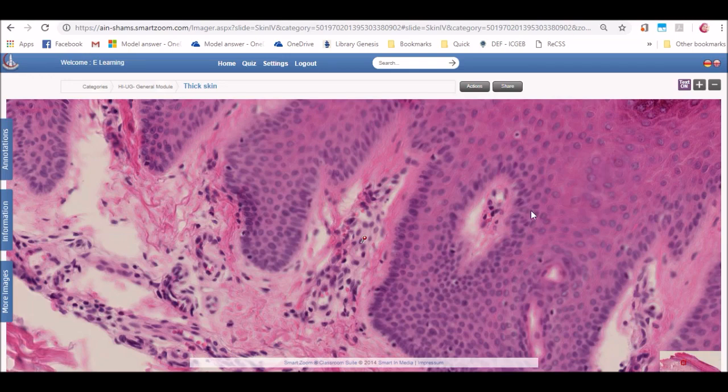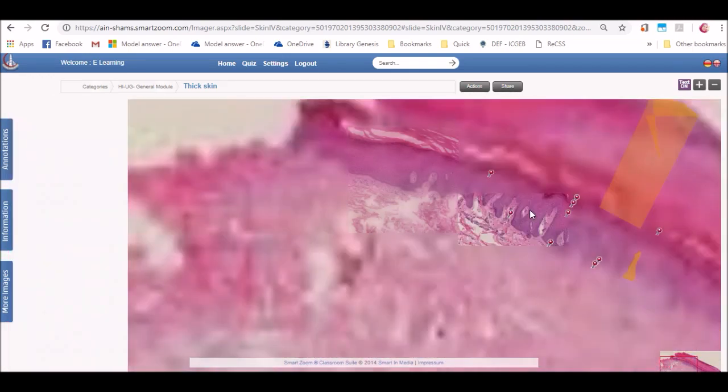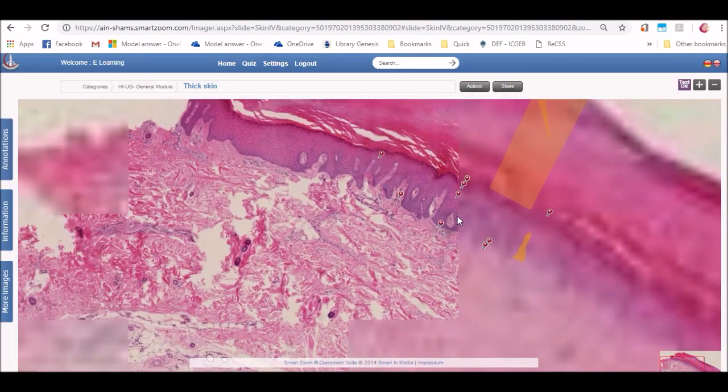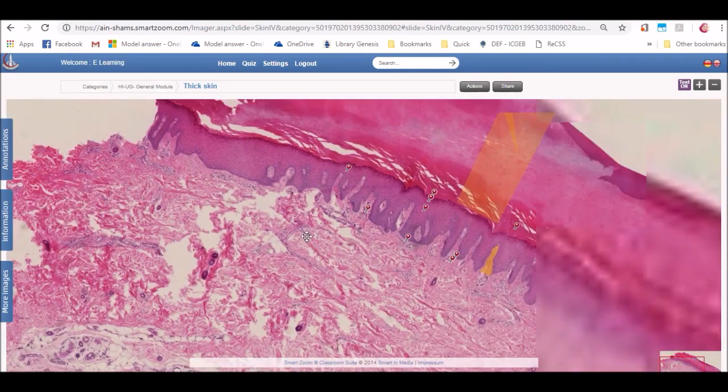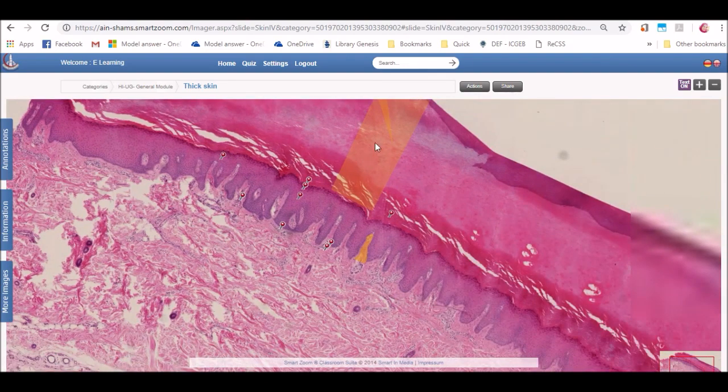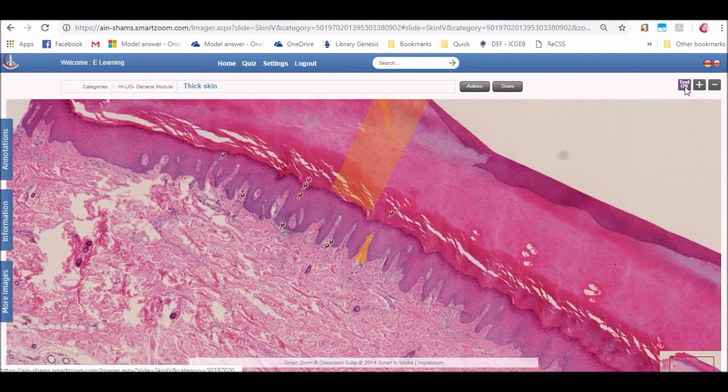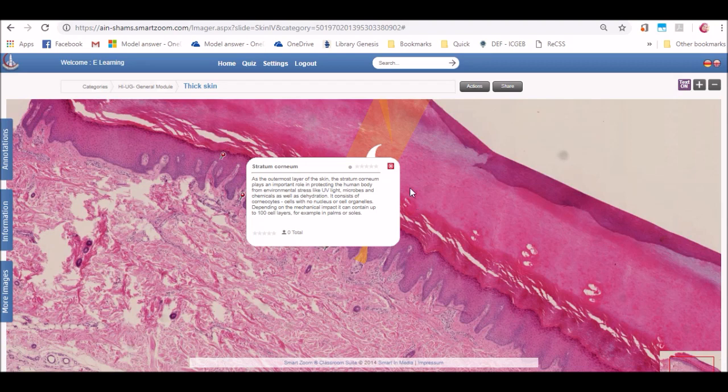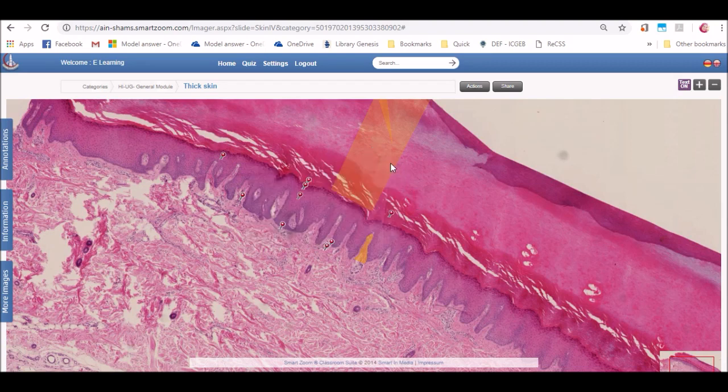If the annotations are blocking the visibility of the structures, you can click on text on or off to remove the annotations, the shape annotations specially and to see the structure which is covered by this shape.